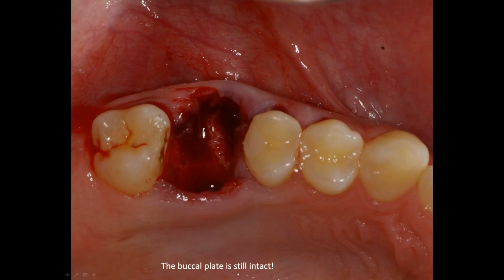Now, we've also noticed that the patient has decay on the mesial aspect of tooth number 2, and she was instructed that when she comes back, we need to address this. Our goal and her chief complaint was to get the tooth out that was causing discomfort for her because of the recurrent decay and abscess into the area, or infection, I should say.